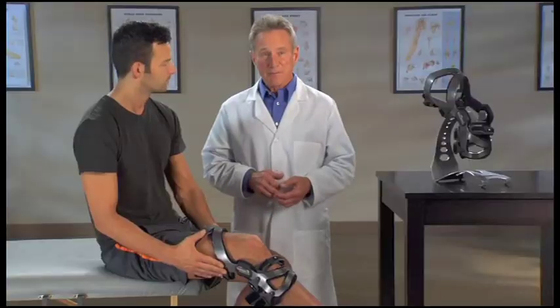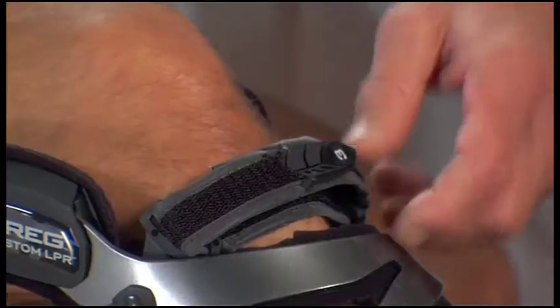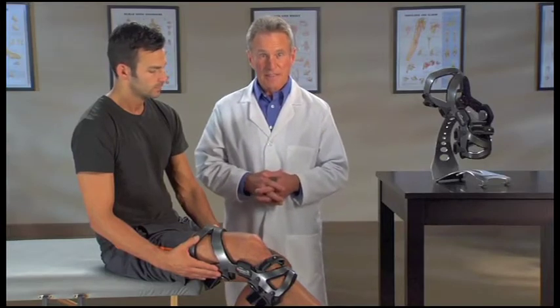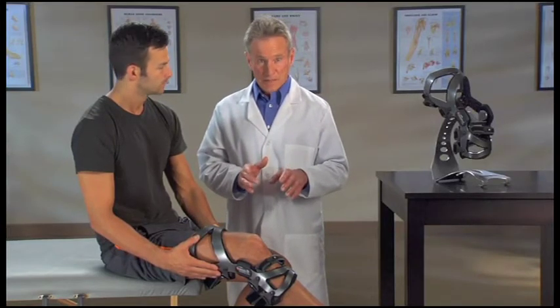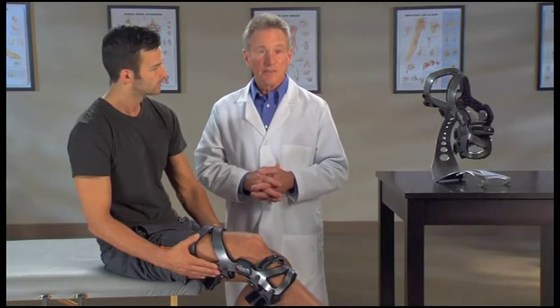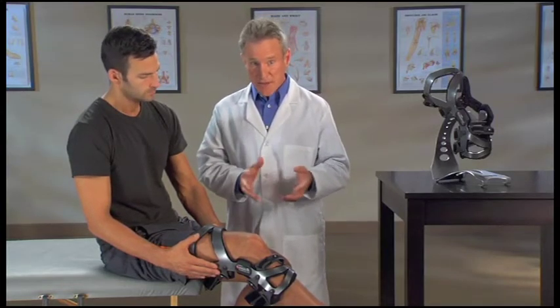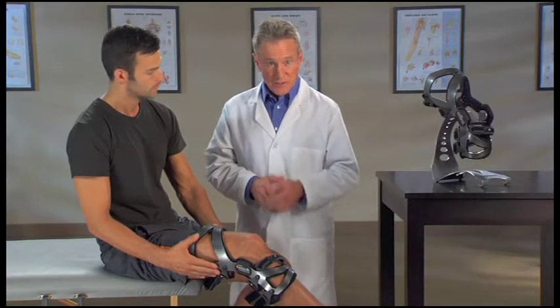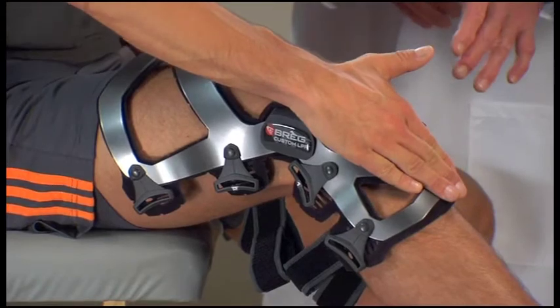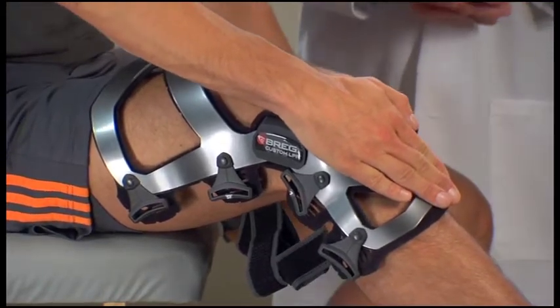Now we'll go through the strapping sequence. The straps are numbered, making it easy to follow the correct order. As you go through the strapping process, make sure each strap is tightened snugly but comfortably and with equal tension so that no one strap is tighter than another. With the brace on your leg, press the shin cuff on the front of the brace flat against your leg and fasten strap one behind the calf.